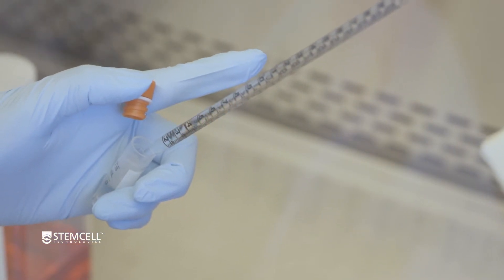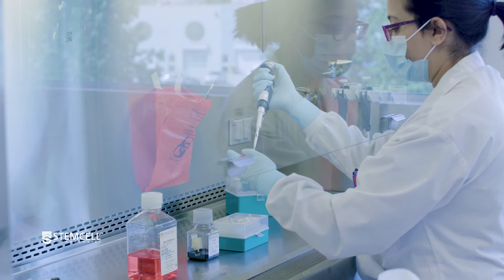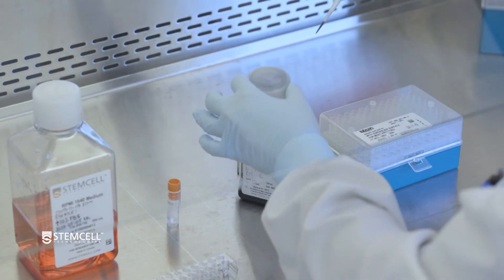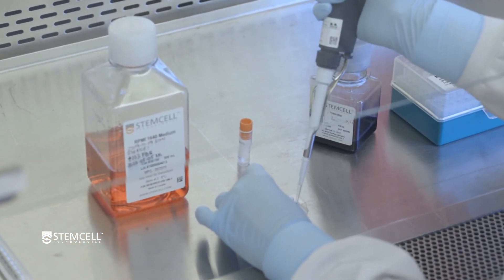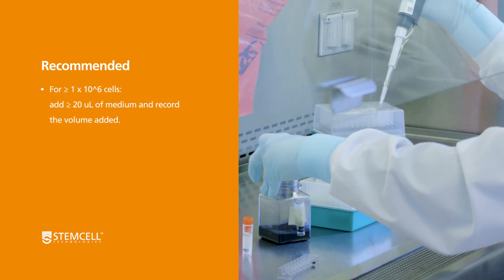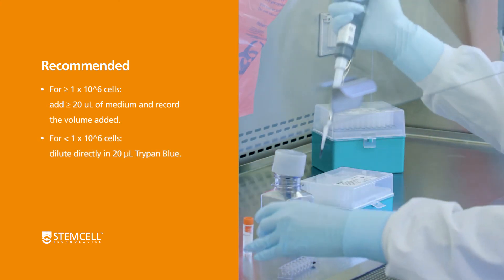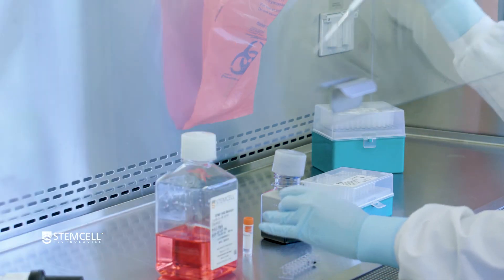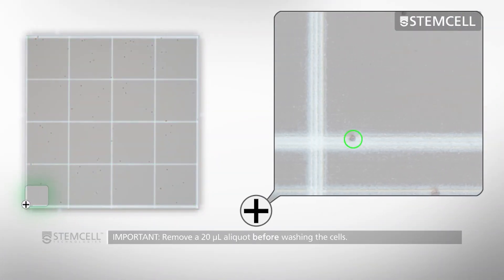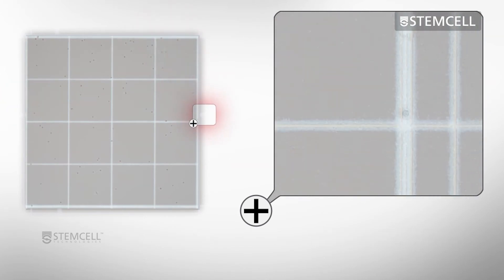Place the cells back into the vial to mix the suspension. Remove a 20 microliter aliquot of cells. Dilute the aliquot with medium or trypan blue and set aside for cell counting with a hemocytometer. For greater than or equal to 1 million cells, add a minimum of 20 microliters of medium and record the volume added. For less than 1 million cells, dilute directly in 20 microliters of trypan blue. It is important to take an aliquot for counting before washing the cells, as this will confirm the number of cells provided and track potential cell loss in the wash process.